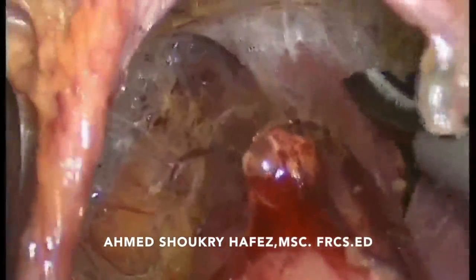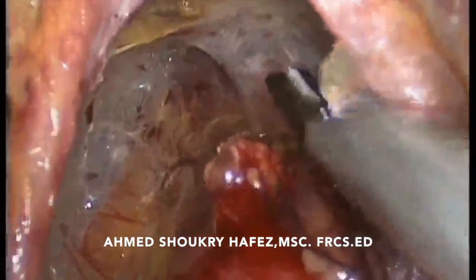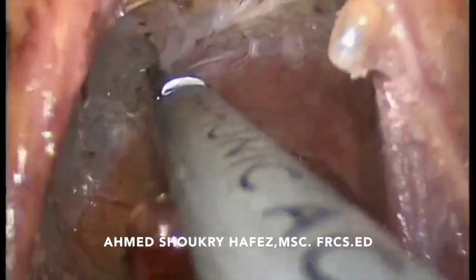The esophagus now is dissected away from the pericardium, and very soon we will be at the level of the inferior pulmonary veins, and this will constitute the upper limit of our mediastinal dissection.